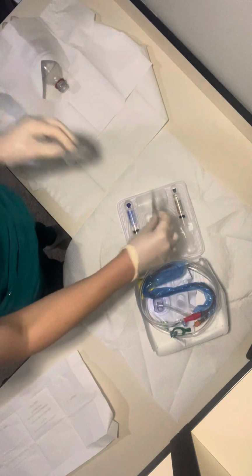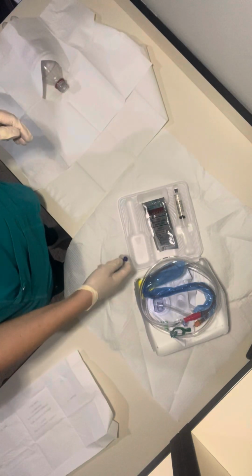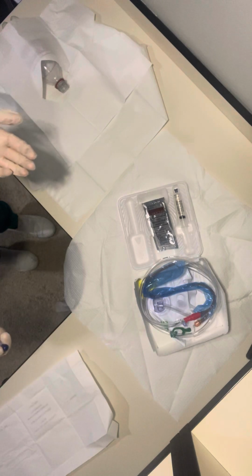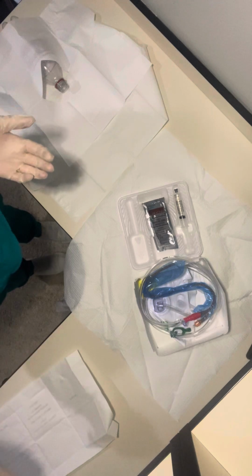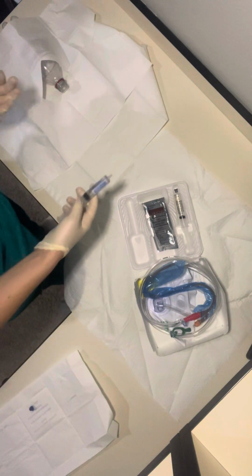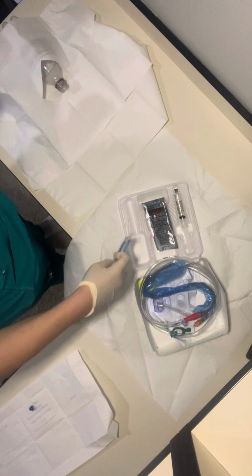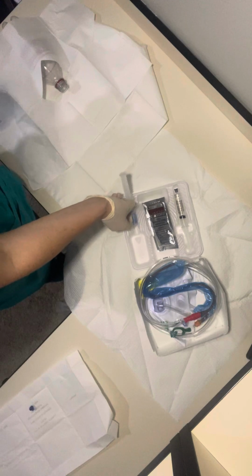You open your swabs. And then I would not drop my hands below my waist. So for the sake of that, instead of dropping it on the floor because it's kind of far, I'm just going to drop it over here. But that is actually the non-sterile area. Okay, so I would put the gel here.